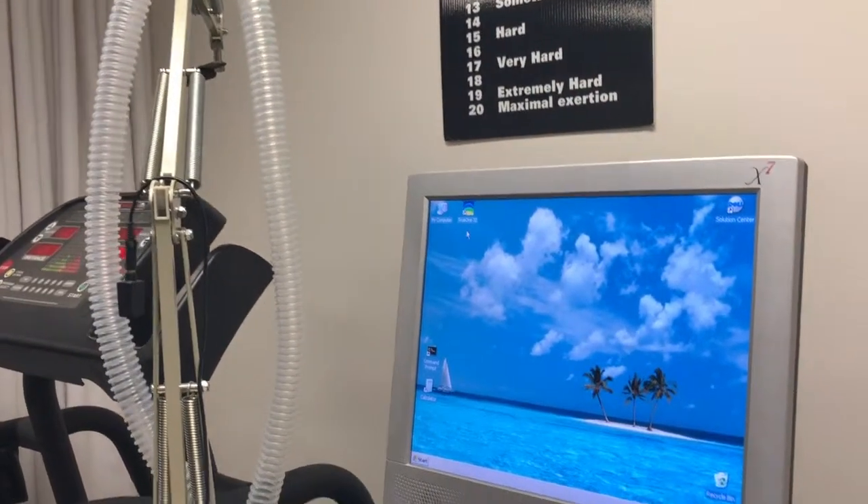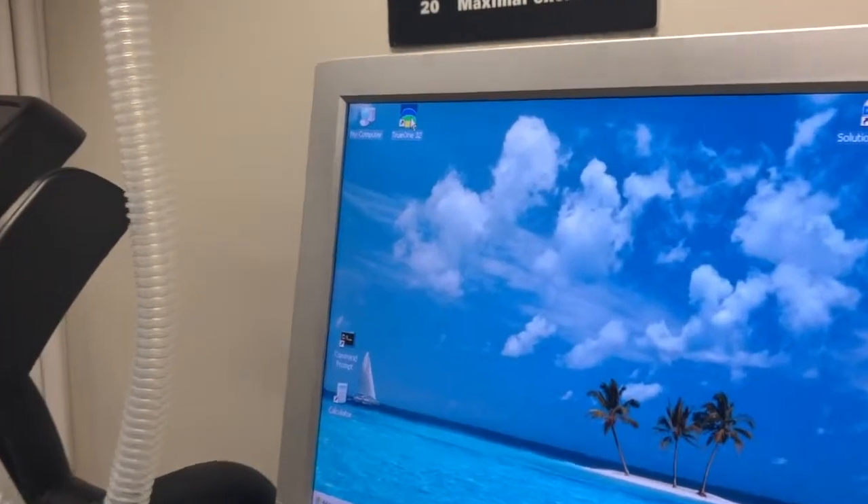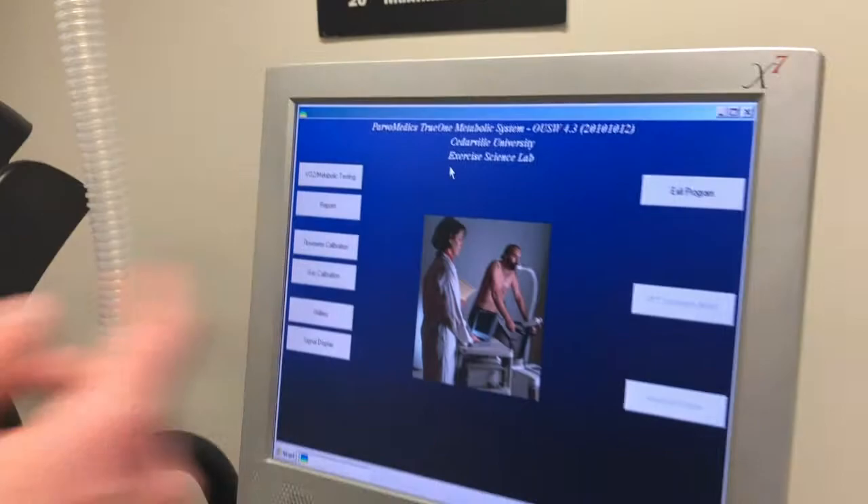The first thing you're going to do is turn on the computer and turn on all the machines. The application you're going to want to pull open is TrueOne. Click on that and that's the screen that should come up.